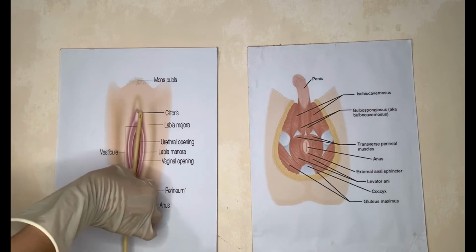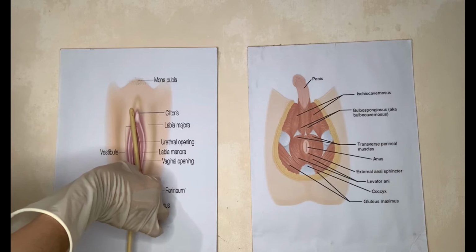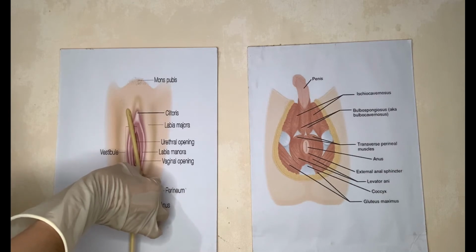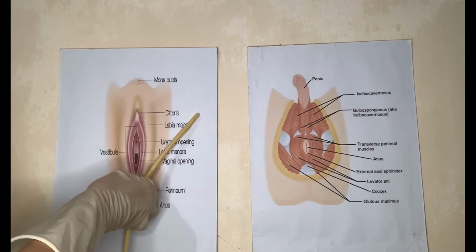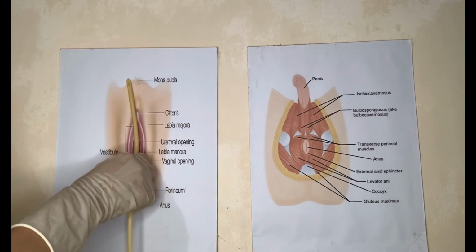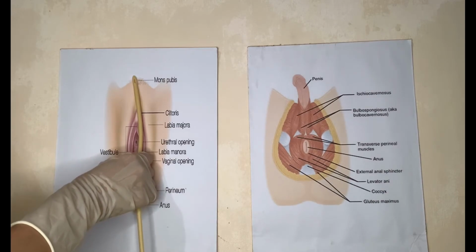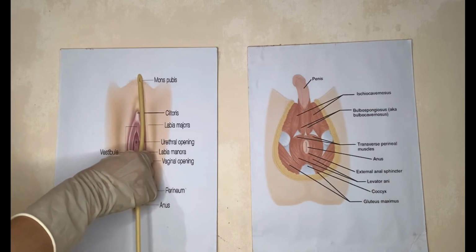So assuming that we have inserted it, if necessary, twist the catheter or hold pressure on the catheter until the sphincter relaxes. So we may now advance the catheter 5 cm or 2 more inches further until urine begins to flow through it. This is to be sure it is fully in the bladder and will not easily fall out, and the balloon is in the bladder completely.